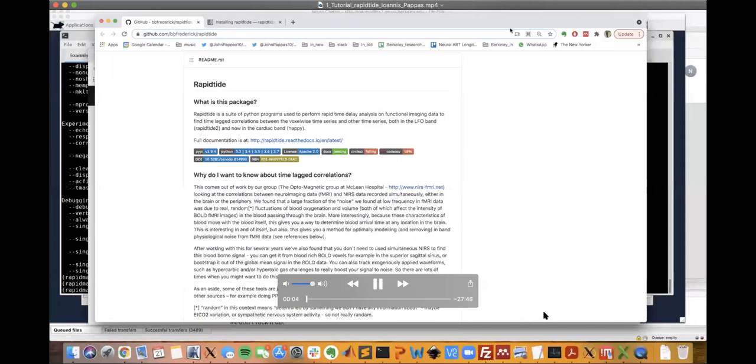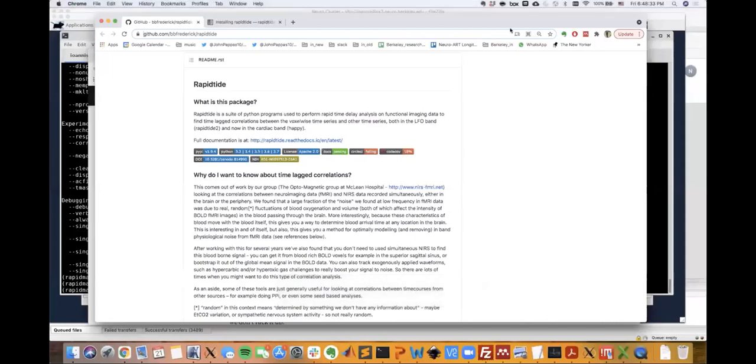Hi, my name is Ioannis Pappas. Hope you enjoyed the conference. In this short tutorial, I will show you a quick and practical way for denoising your fMRI data from the low-frequency oscillation signal. Okay, here we go. This analysis will be performed using Dr. Blaise Frederick's RapidTide software package. First, download the latest version of RapidTide from Blaise's GitHub page as shown on the screen.